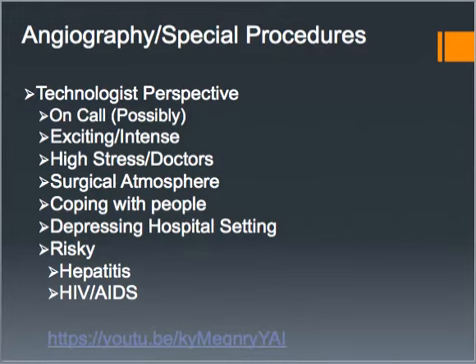So it's kind of neat just to see the perspective of just a quick little snippet of what they do and how the room's set up and how they function. And I don't know if you noticed at the bottom how she was using those different controls on the table to move the machine and do things there. And they all had lead aprons on. I didn't know if you noticed that, with radiation monitor badges, not to protect the patients, I'm sorry, but to help monitor how much radiation you're getting.